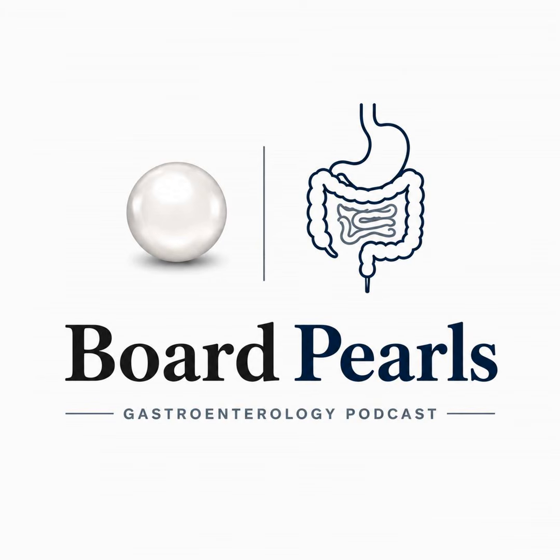So the layer plus the echo texture gives you a working diagnosis, and the working diagnosis tells you whether you even need a needle. A bright submucosal lipoma usually needs nothing. A dark layer 4 mass at or above 2 centimeters needs tissue. And once you decide to sample, the question shifts from where the lesion is to what answer the tissue has to provide, because that determines which needle you reach for.